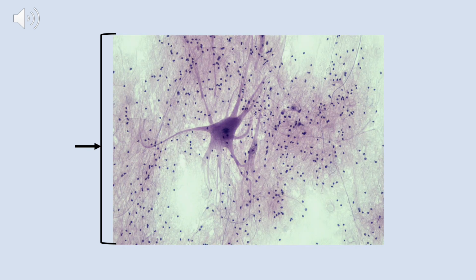Here we have a nervous tissue slide, and we don't need to go into the specific tissue types because we don't really do that. Later on we'll talk about the different kinds of cells that we encounter in nervous tissue, but for right now you really just need to know it's nervous tissue. That should be clear from the big neuron that's right in the center of the slide. That looks a bit like an octopus or a squid with all those tentacles coming out.